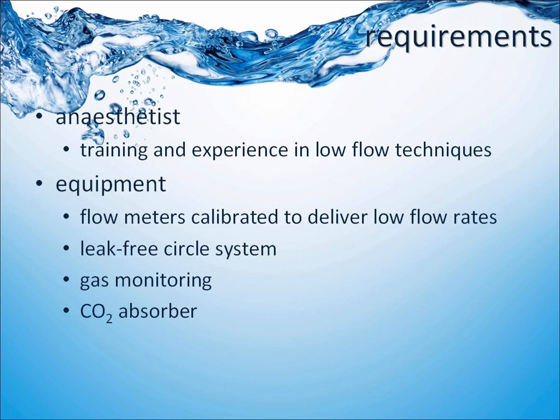So what do you need to start your fresh minimum flow anesthesia? You need an anaesthetist who's trained and experienced in the low flow rates, and you need someone to teach you how to administer it, and then what to do for troubleshooting as well.